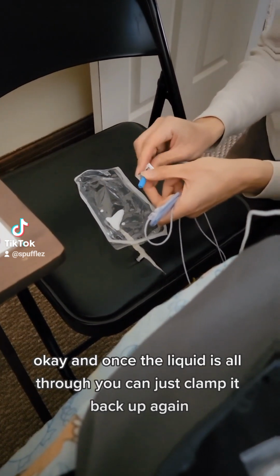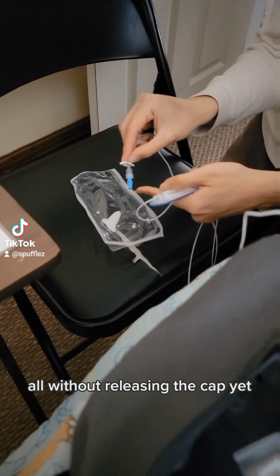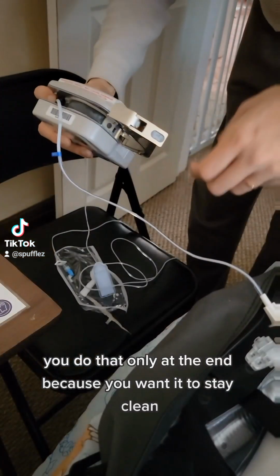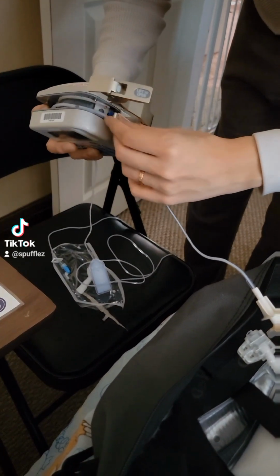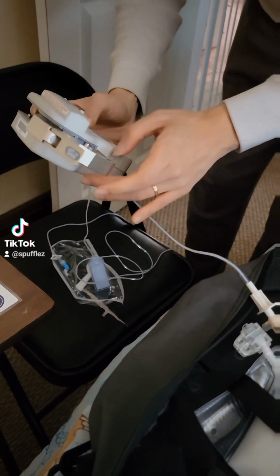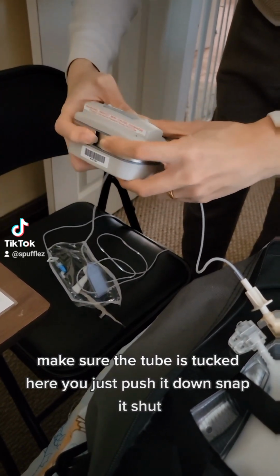Okay, and once the liquid is all through, you can just clamp it back up. Again, all without releasing the cap yet. You do that only at the end because you want it to stay clean. Okay. And the blue one goes in the blue hole. Make sure the tube is tucked here. You just push it down, snap it shut.